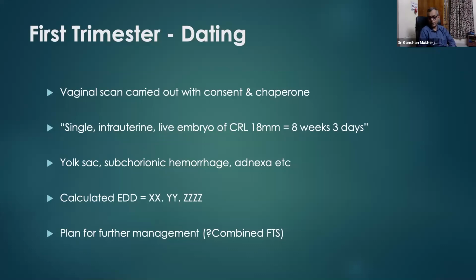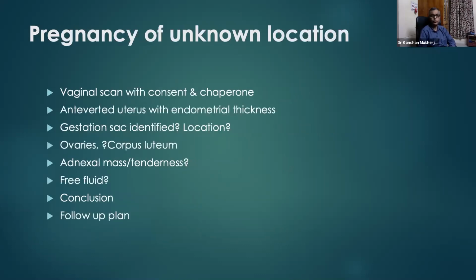And then you should guide them also about further management, like combined first trimester screening. You should give them an idea when that should be done.